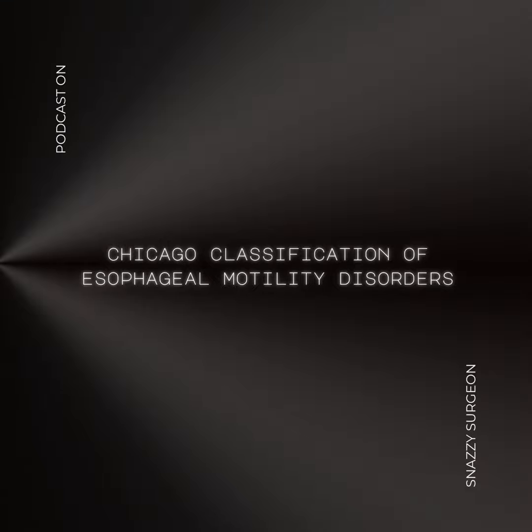So to sum it all up, the Chicago classification is our essential tool for understanding and categorizing esophageal motility disorders based on high-resolution manometry. It gives us this detailed, precise way to define different conditions based on specific manometric patterns, especially focusing on those IRP and DCI values. It might seem technical at first glance, but the ultimate goal is to give us a clearer picture of how the esophagus is working or not working, so we can provide the best possible care for our patients. Couldn't have said it better myself. It leads to more accurate diagnoses and ultimately helps us come up with the most appropriate treatment strategies for our patients who are dealing with these sometimes very challenging esophageal disorders.